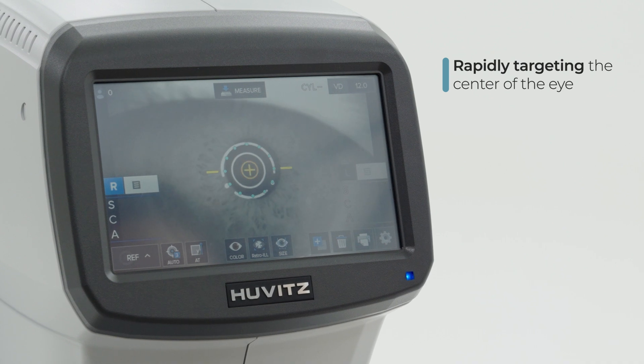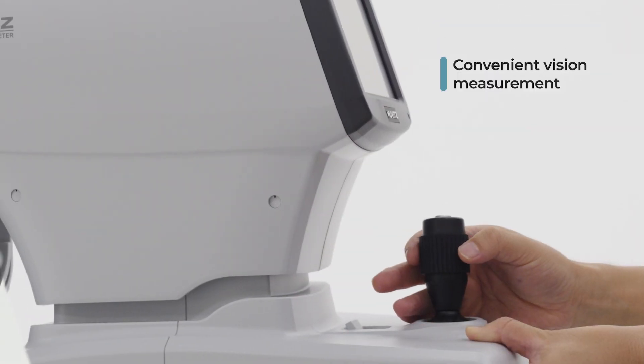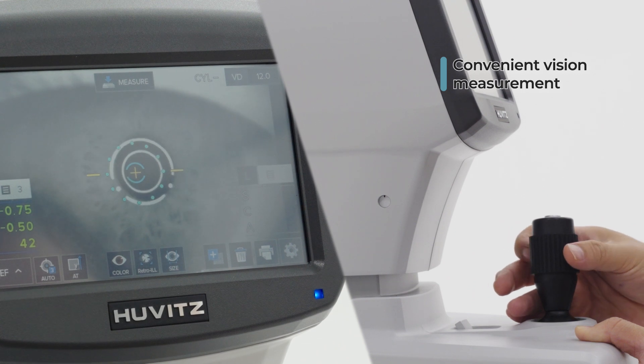At any point of the patient's cornea toward the aiming dot, with the fast targeting of the center of an eye, it makes it easy to measure conveniently.